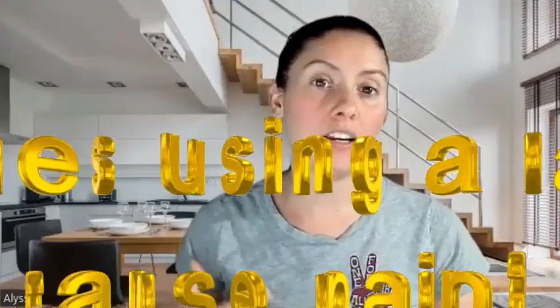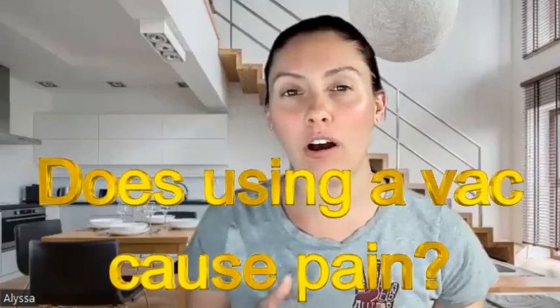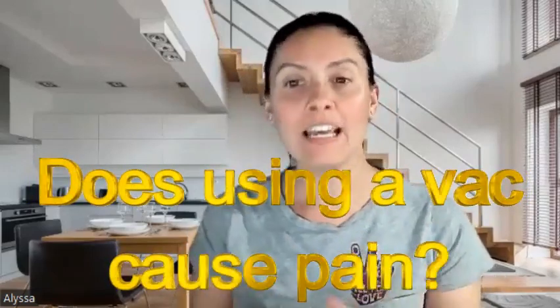Now, I get this question a lot. Does using a VAC dressing cause pain? It really shouldn't cause any actual pain. You might feel a little bit of stretching or pulling around the wound, but it shouldn't be something that causes actual pain. If there is pain associated with the VAC, this can indicate a complication going on. So you would want to get a hold of your healthcare professional right away, and they should be showing you how to use the machine in case something happens where you could turn it off.